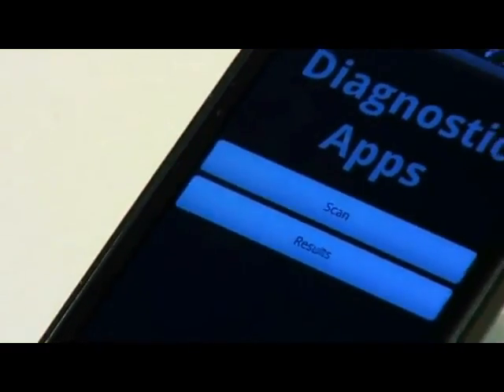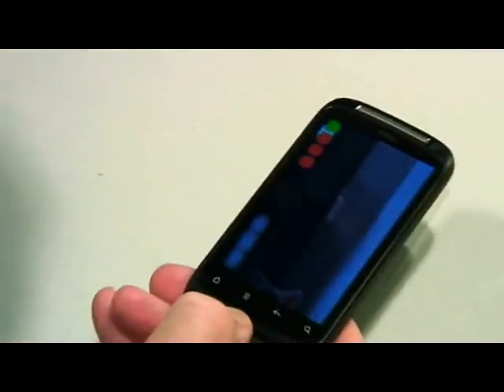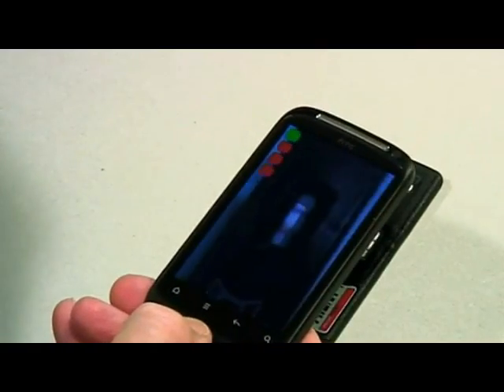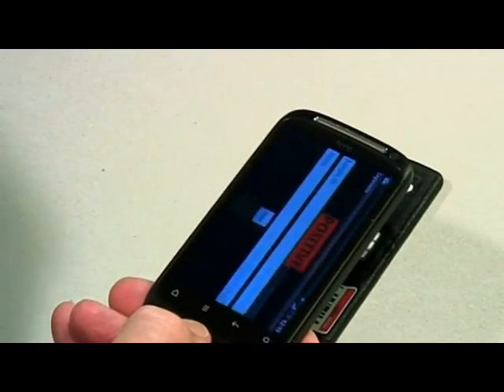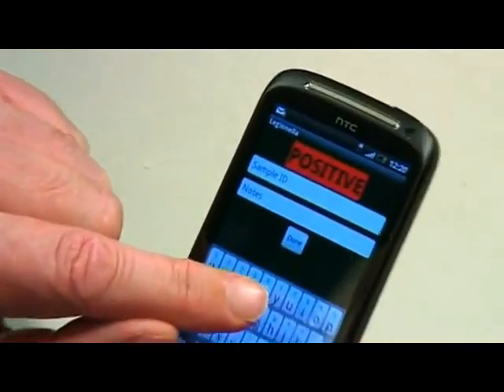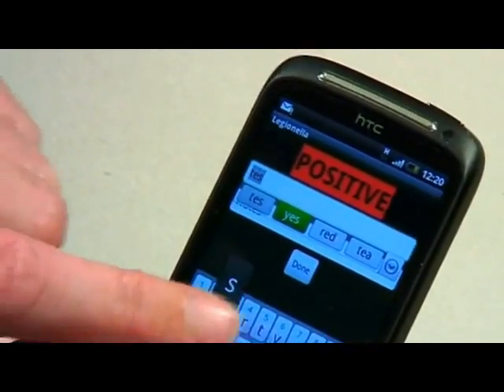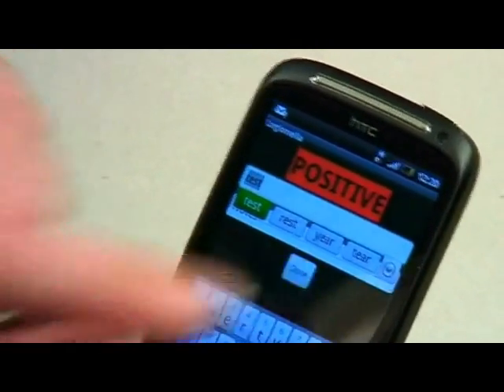Using our patented image processing techniques, the CameraPhone dynamically assesses image quality, focus, lighting and orientation to quantify the test result.